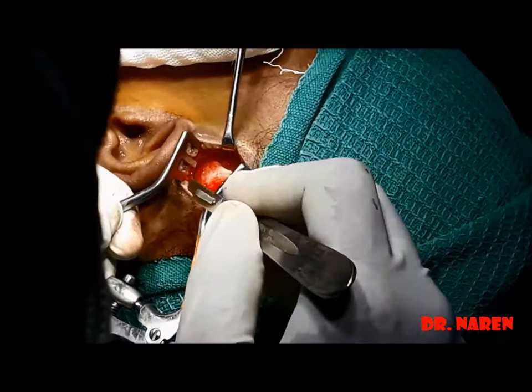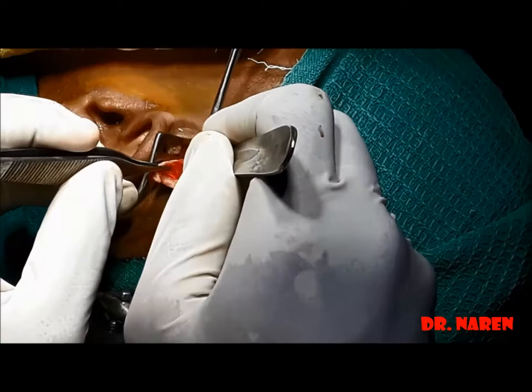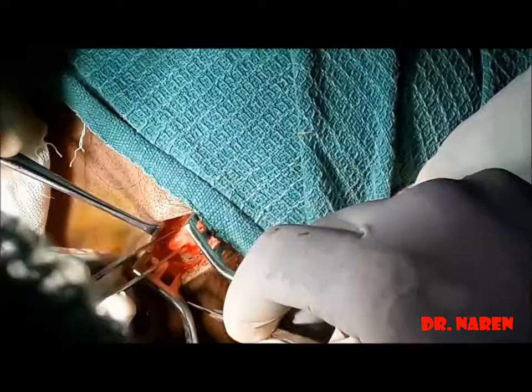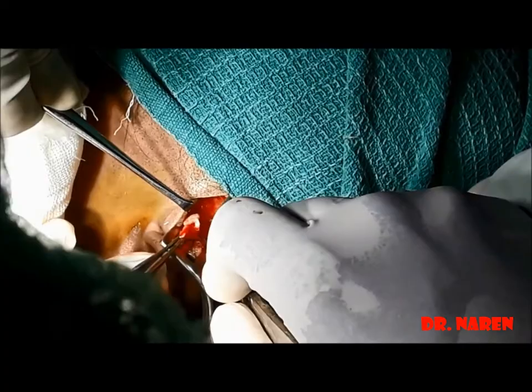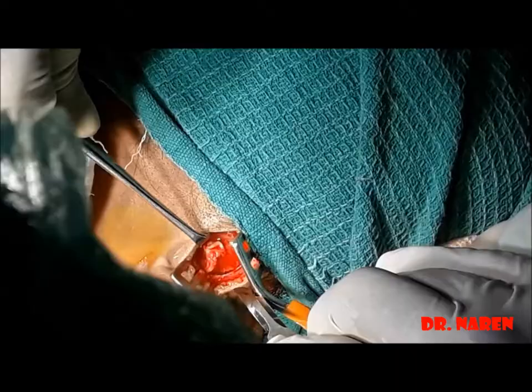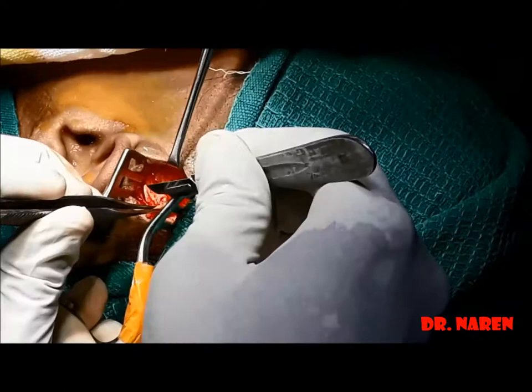On the other hand, the inferior thick strip of fascia is good for support of the temporalis muscle when used as a superiorly based muscle flap in cavity obliteration. For this reason, the inferior strip should stay connected to the muscle. Here you can see I am just removing the fascia from the attachments of the muscle — tease out, tease out — without tearing the fascia. The encircled incision is just connected and the fascia is teased out.